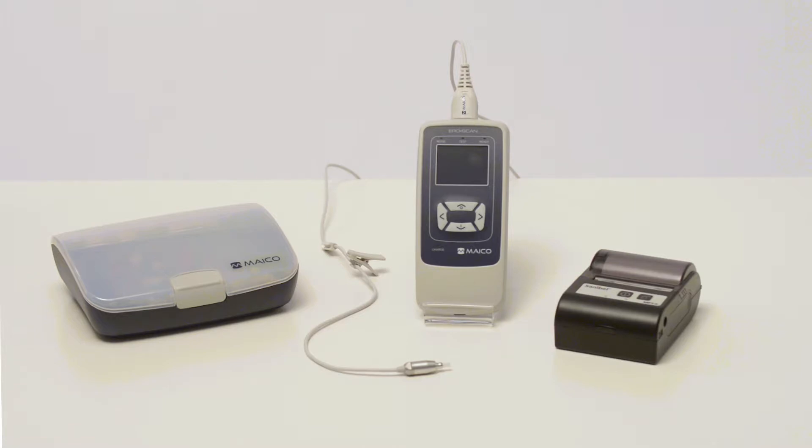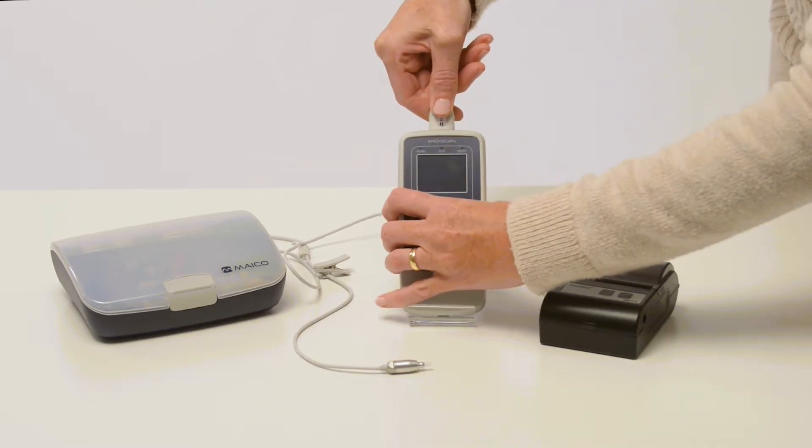This demo is to show you how to set up and use the Mako AeroScan OAE screener. Before using the AeroScan, attach the probe to the end of the device.